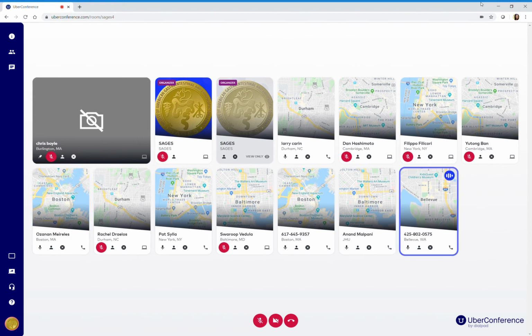It also seems, from the spreadsheet, that perhaps there is a distinction between labels that are intended for segmentation, i.e. you would trace an outline around that particular label, versus labels that are more like tags. So perhaps inflammation is a tag, not necessarily a certain area that is traced. Or maybe it is an area that is traced, but it seems useful to define whether all of those labels correspond to something that needs an outline, or if some of them can be thought of as tags on top of a structure that's been outlined.